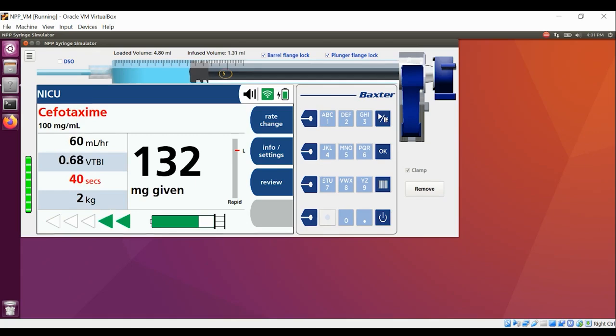Now, what occurs sometimes is that 2 ml flush volume may be greater than the drug volume that I delivered. So the user may need to deliver the flush as a volume over time. So I will show you how that's done as well. Looks like we're getting close to the end of this delivery here. What I would expect is that I will get an infusion complete.